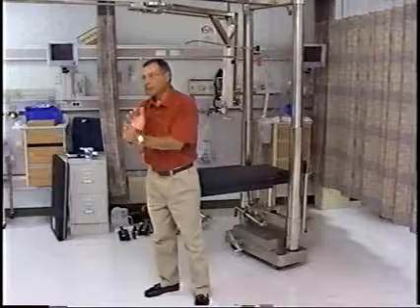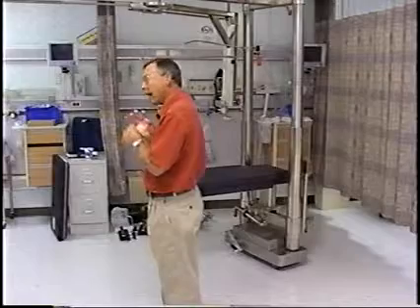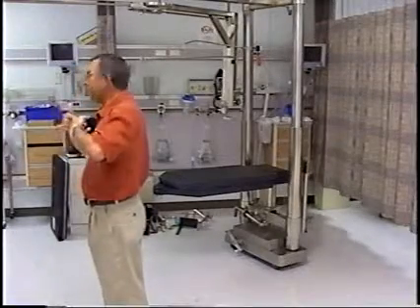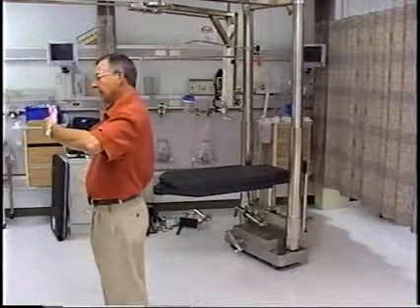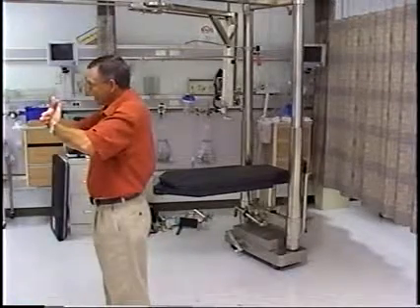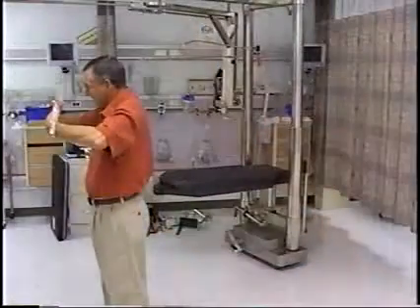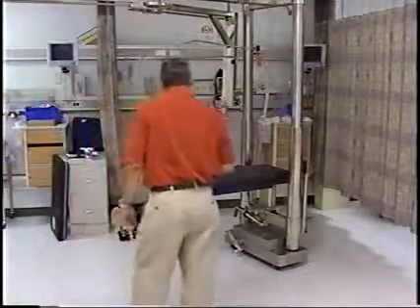There are three things you need for orthopedic surgery. You need a means of pulling traction, okay? And remember, in orthopedic surgery, you're not pulling traction against the bone, you're pulling traction against the muscles. Imagine that this is a femur or a hip, and the bone breaks. And when it breaks, those muscles contract. So in order to get those bones realigned, you have to pull the muscles, not the bone. So we're going to be pulling a lot of traction in order to get the bone realigned.